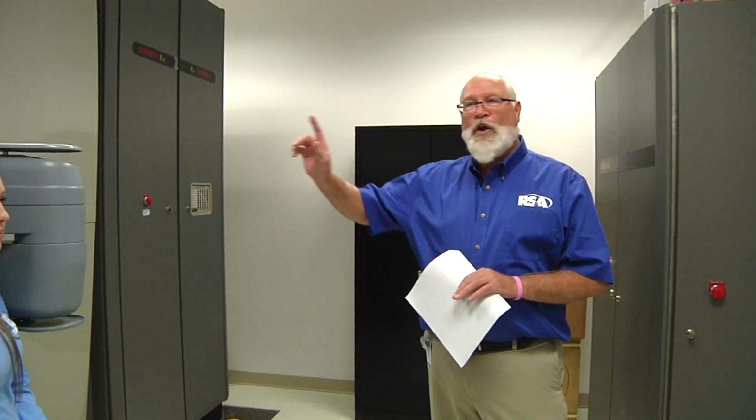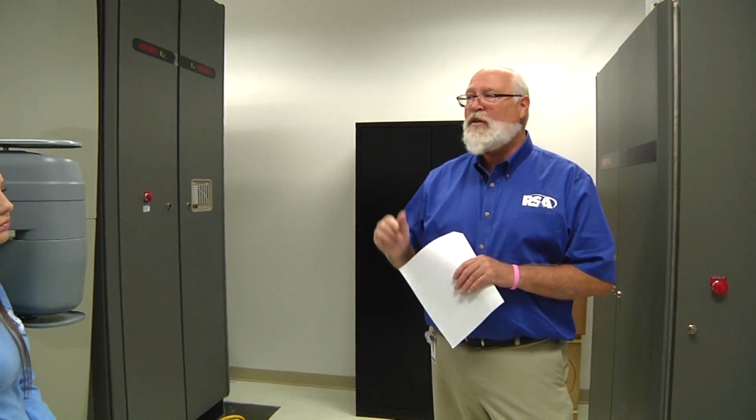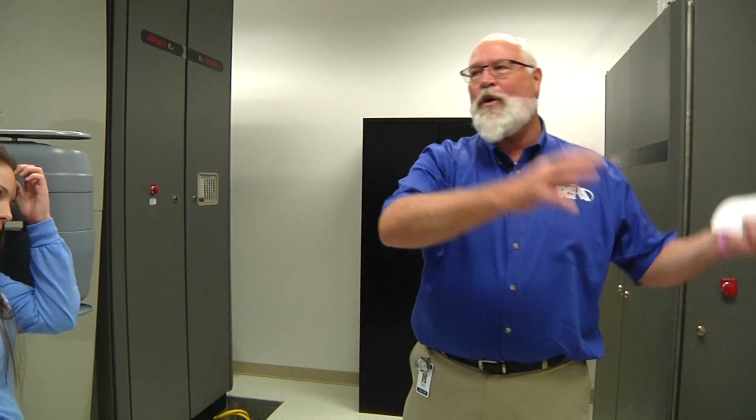So one thing we have you check before you rotate the gantry is to look on the floor and make sure there's not a puddle of water on the floor. So we have you park the gantry at a certain position. On an OBI machine, it's roughly 4 or 5 o'clock, and we ask you to rotate the collimator to 90 degrees. Why we do that is because if there's a water leak in the head of the machine, it doesn't drip into the electrical components. Because I just said they're pretty expensive, right? So if you rotate the gantry, one thing the fiberglass will do, those covers, they'll hold a lot of water. So when you rotate the gantry, now you put all that water into all your electronics. And it makes maybe an hour job to repair, maybe half a day.